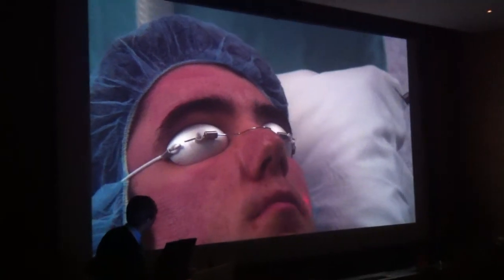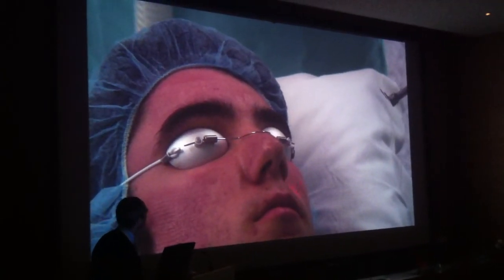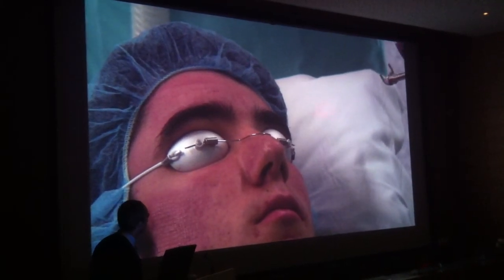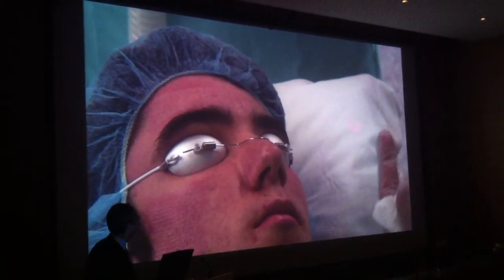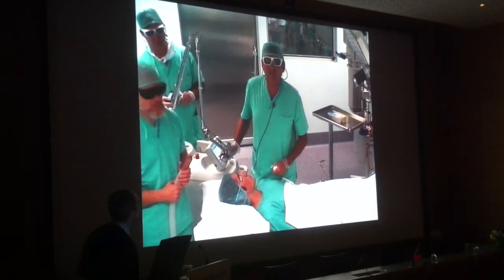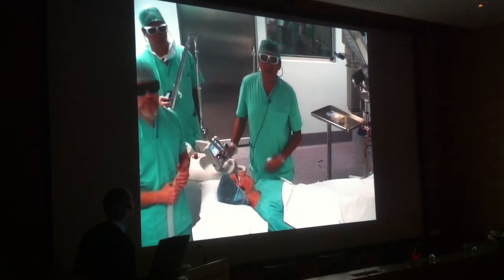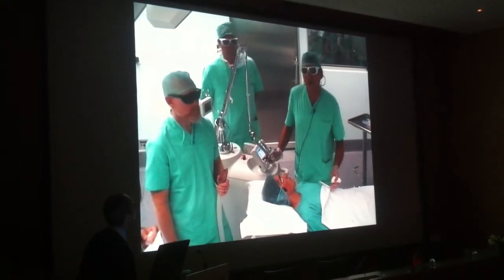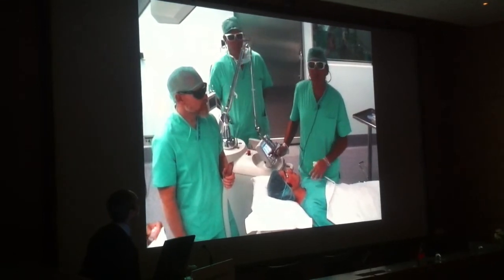The other thing is that I think that after all, the most important thing is to have a correlation between what happens in histology and your parameters, and not just the aggression of the skin that we see very often. So again, let's think about regenerating, promoting regeneration, and not mutilating, at least in young patients like this.